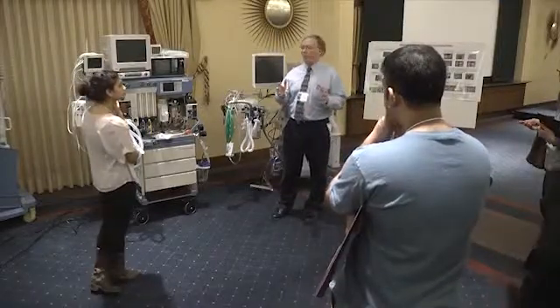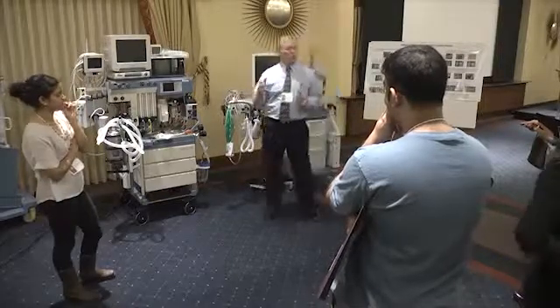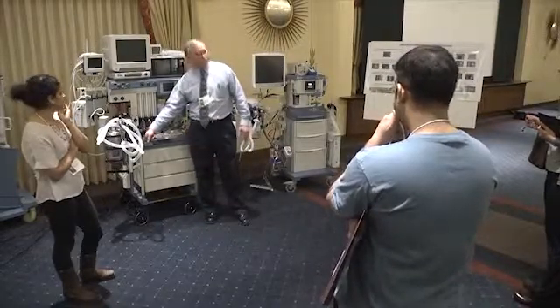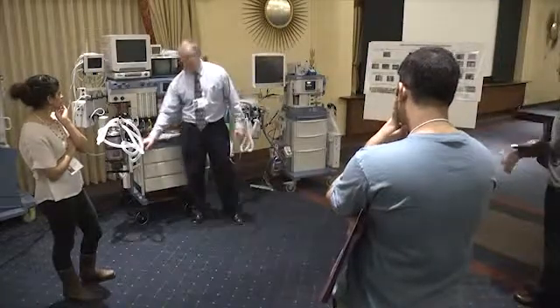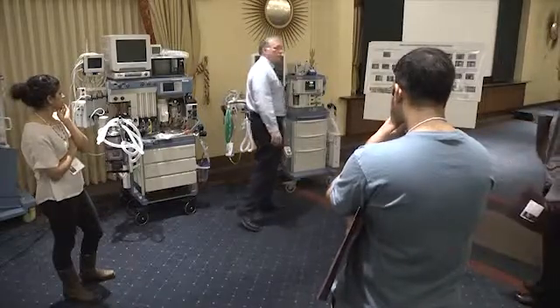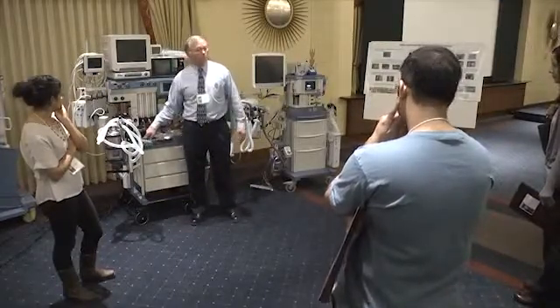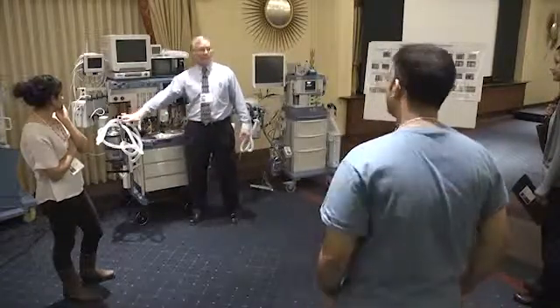Because, and that's why I said this is the Draeger line. If we look at the GE line of machines, one of the differences that they have is there's a check valve right at this point right here, where the common gas outlet hose comes out of the machine. So all your gas from this whole machine leaves this black hose, just like it leaves this black hose over here. Okay? This is the output of your machine. When this comes out of here, they put a check valve in so that when you pressurize, it won't go in. You can't positive pressurize this via this component.